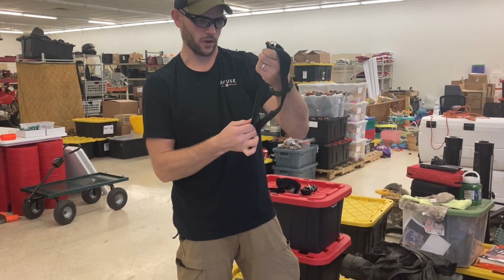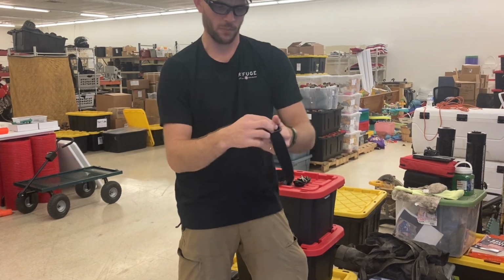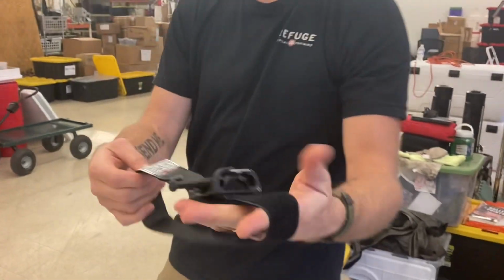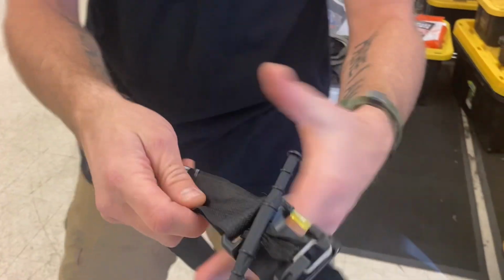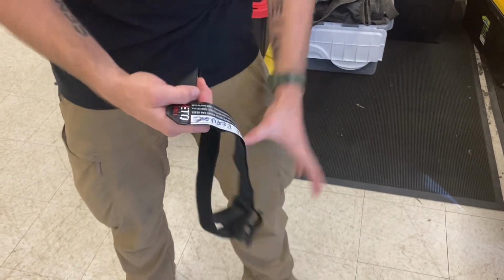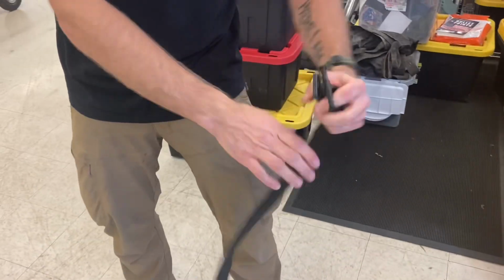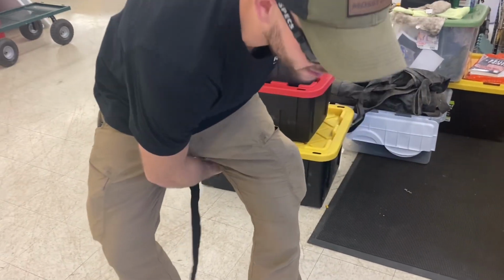All right, so we're started as close to straight up as I can. Buckles back in place. Okay, so everything's normal-ish, but it's still bound up really good. Cool. For the sake of it, let's say I'm pinned in a car, right? I've already taken the stuff out of my pockets. It's already binding itself.